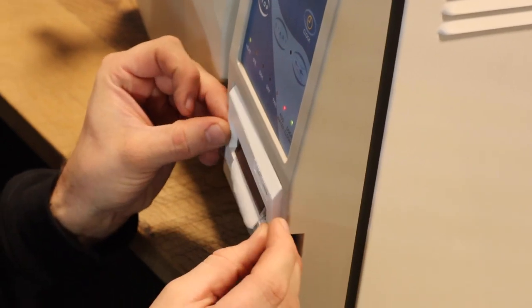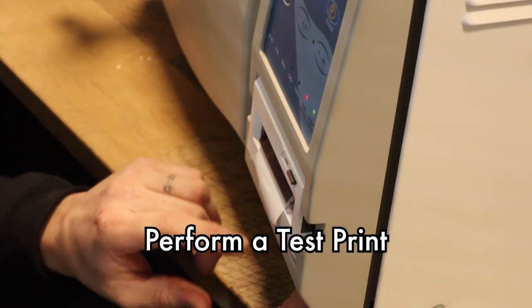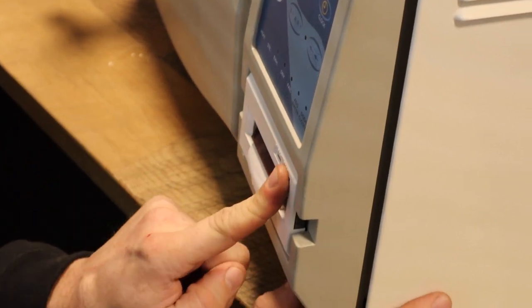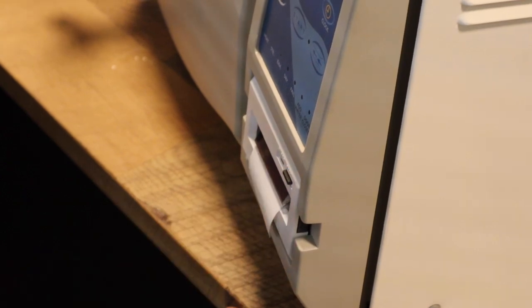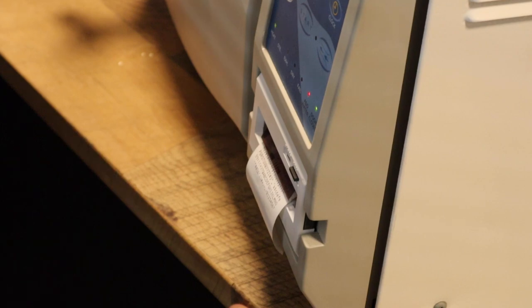You want to make sure you get that feed button all the way through. We're going to now do a check to make sure this printer is working right. So we're going to turn the unit off at the front, press and hold the feed button, and turn the unit on. Once it starts printing, it is going to go through and print an entire cutout.